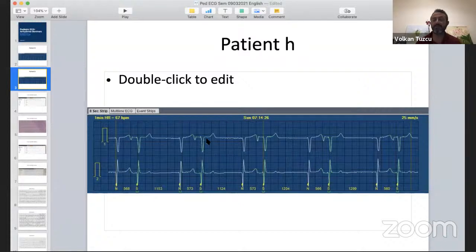If this was a patient in the ICU, we see these situations a lot, actually. When you're not sure whether the QRS is narrow or not, first of all, always compare the ECGs to previous ones. This is very important, especially in operated patients, congenital heart disease, in the ICU setting, ED setting. If the rhythm is not normal looking, especially if the QRS is somehow different, or the ST segment is not normal looking compared to the previous ECG, this is extremely important in our complex congenital heart disease patients. So let's say this strip was not available, we would still need to have this information.